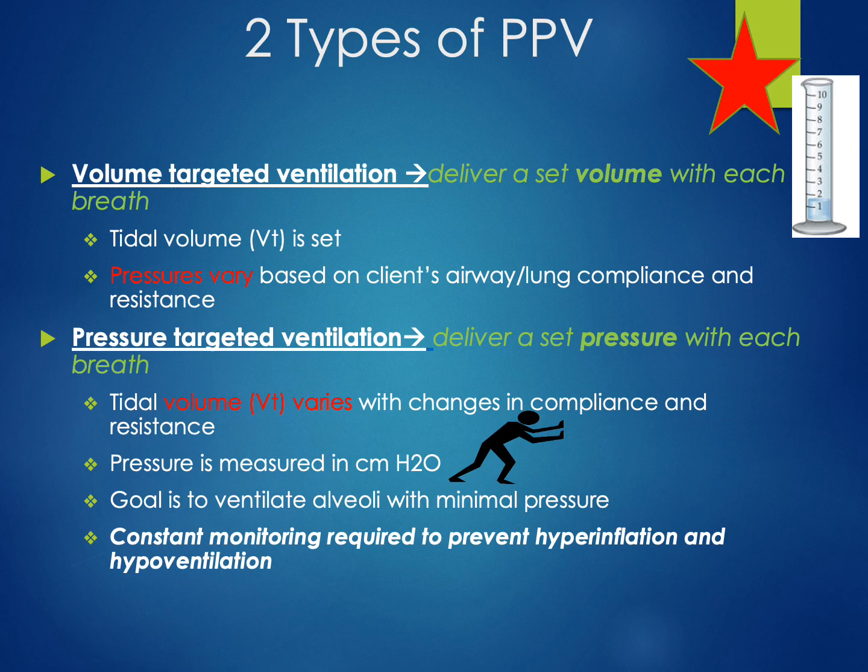So now thinking about the differences between volume versus pressure regulated ventilation, what do you as the nurse need to think about depending on if your patient is on a volume or a pressure mode? Well, think about yourself at the water pump again. If you just push as hard as you can, what could happen to the water in your bucket? It could overflow. Now, you weren't really focused on the bucket, you were focused on the effort.